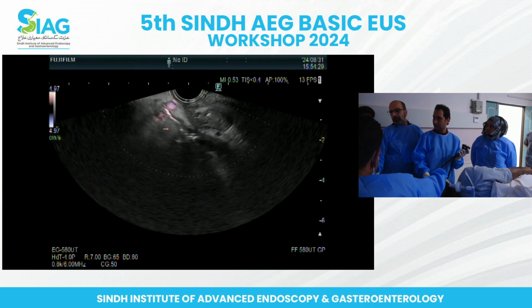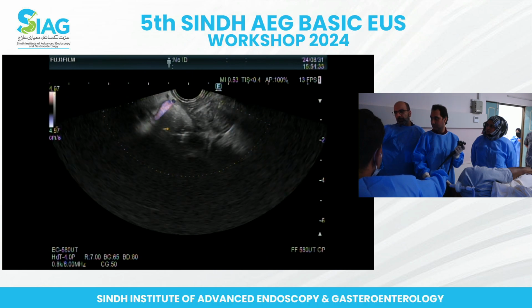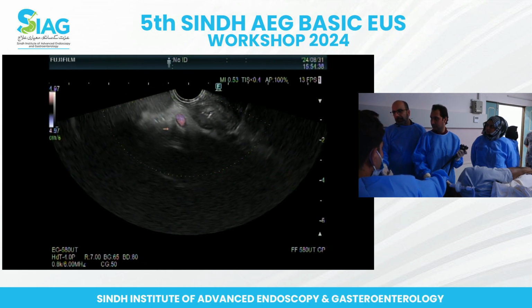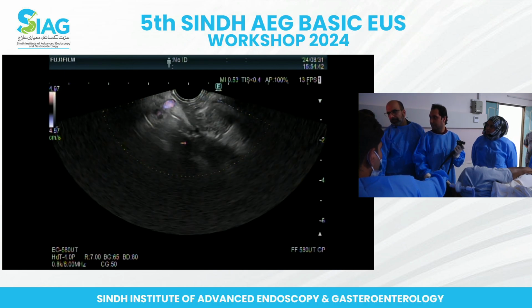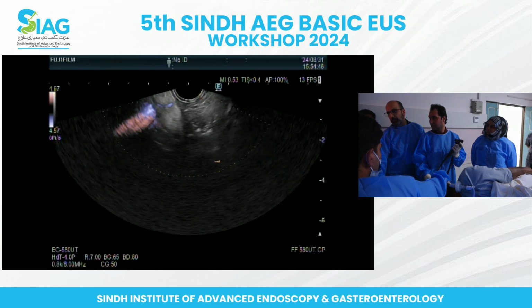So now start going clockwise. Now as you go clockwise, it'll fall away from you. So you have to big wheel towards you. So you have to anticipate that. So go clockwise, and it's going to go down to the right. So you have to do big wheel towards you and keep going clockwise.